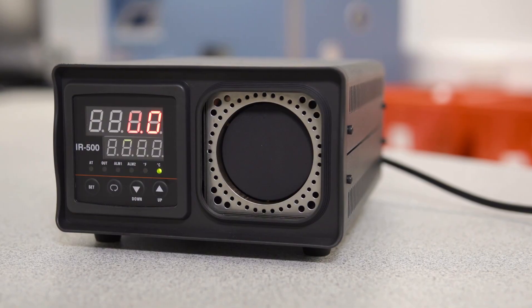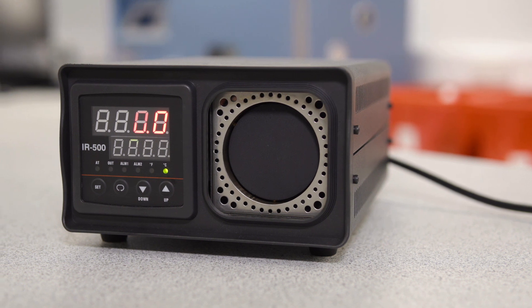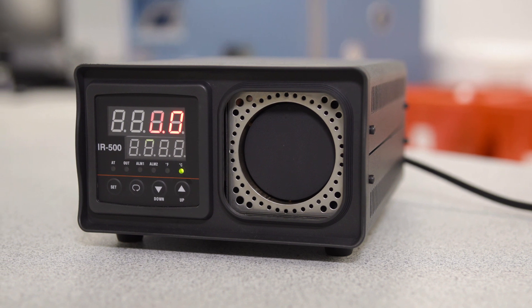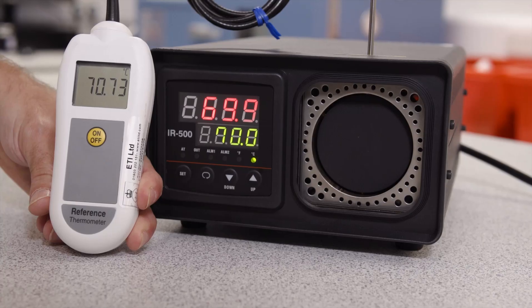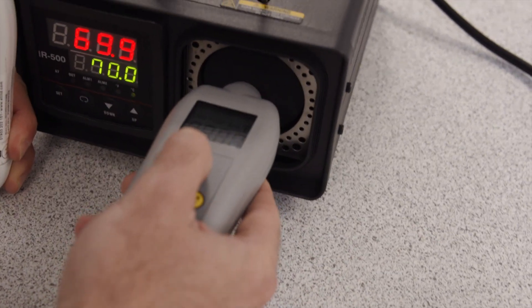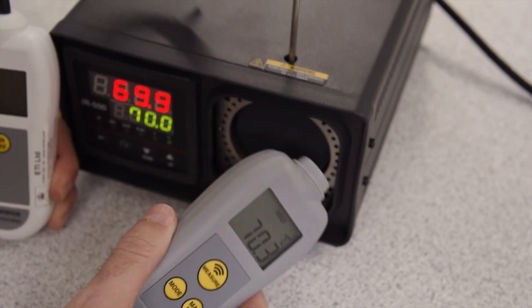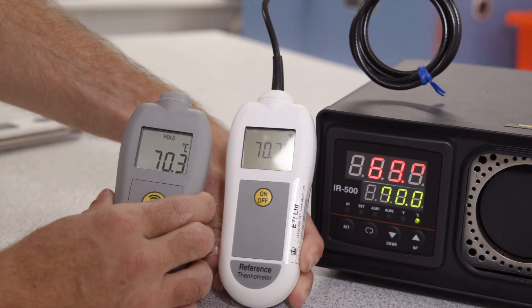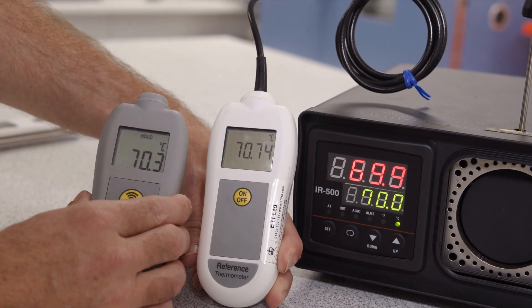In contrast, our IR500 black body calibrator creates stable temperatures of 50 up to 500 degrees C for infrared calibration. Suitable for checking multiple infrared thermometers regularly, this is an easier and more accurate method. This device is best used alongside a calibrated thermometer for maximum confidence in the accuracy of your tests.